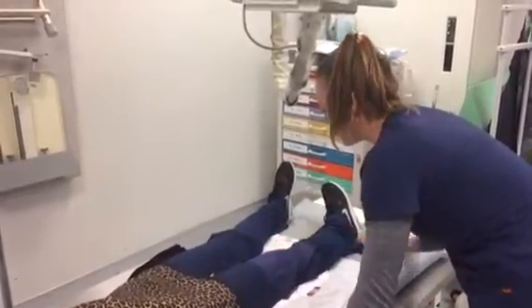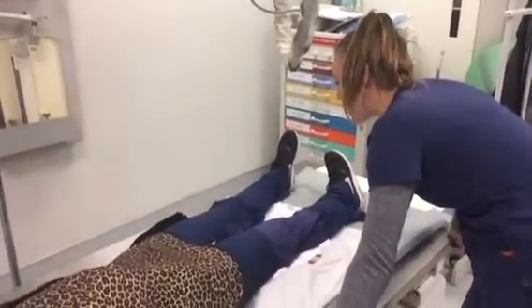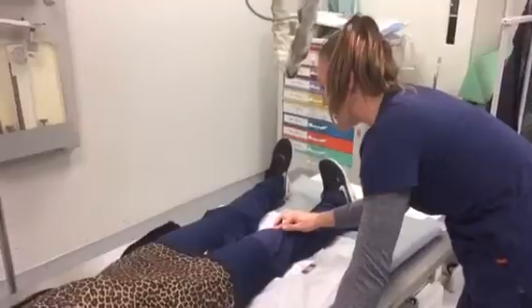The central ray will also enter half an inch below the apex of the patella.